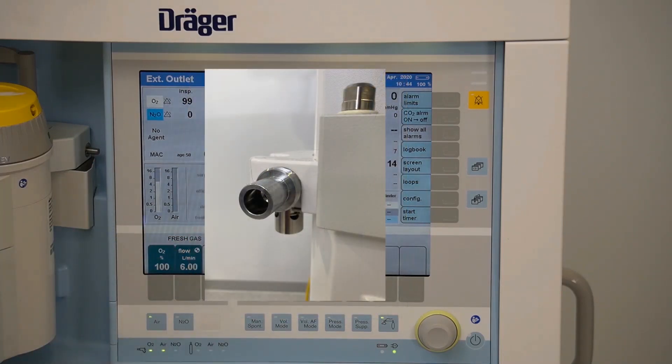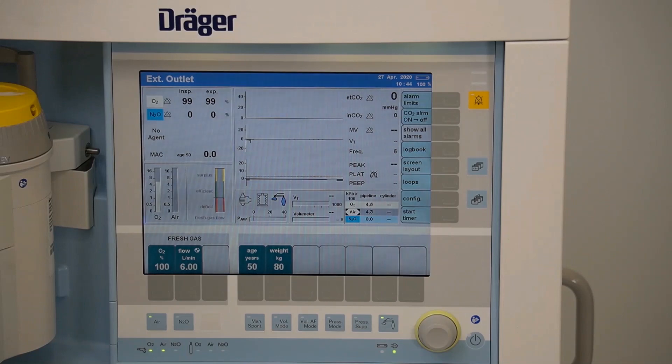To end a case, press standby and confirm with the rotary knob. All fresh gas delivery is now ceased.